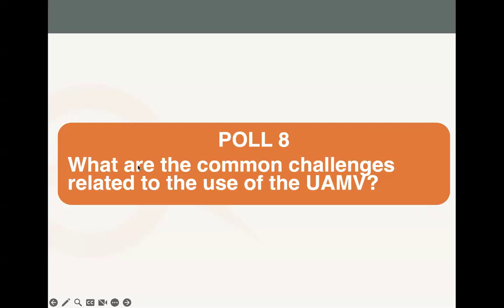So also just to emphasize that, the flow sensor is a very important part of ventilation, because even for ICU ventilators, you also have a flow sensor there. Same applies to anesthesia machine ventilators as well. So it's a very key component, and that's why you see it coming with a lot of emphasis.